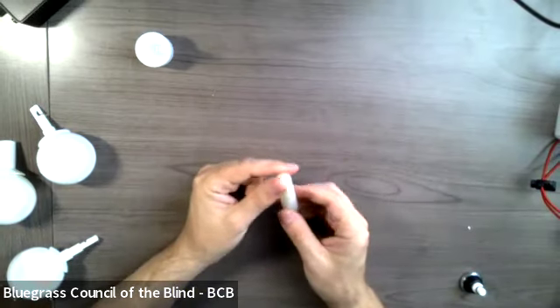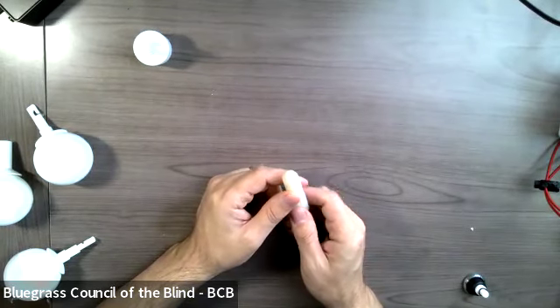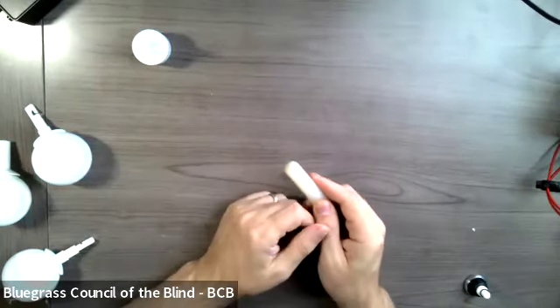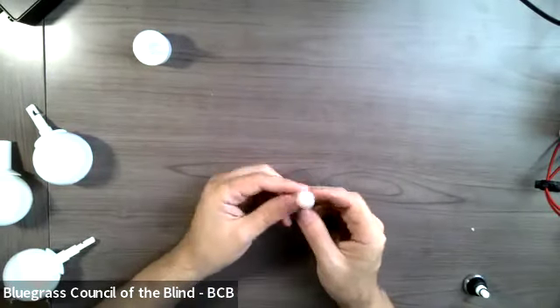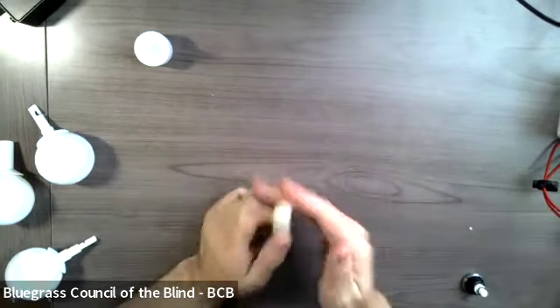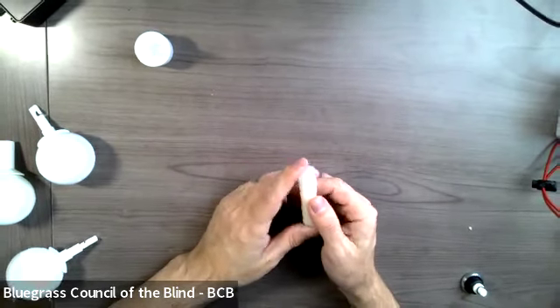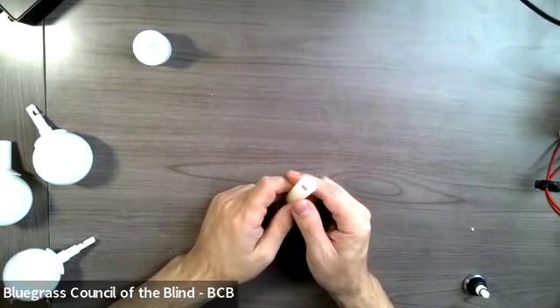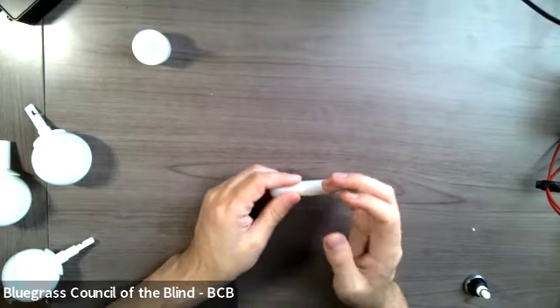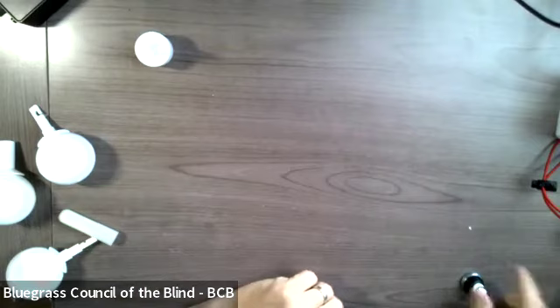Because this has such a sharp end like this, it's going to get stuck in everything. Every little crack, every little bump, every little nook and cranny, it's going to get stuck in that if you're using it that way. So the pencil tip could be used for 2-point touch, but it's going to be great for identification. It's going to be great for light probing. So if somebody just needs a cane to test how deep the steps are, how deep the curb is, that's where the pencil tip is going to come in and work really well.